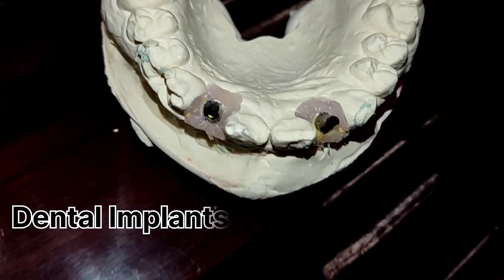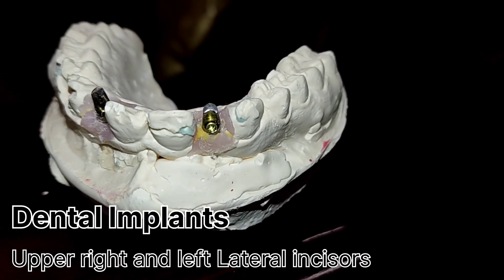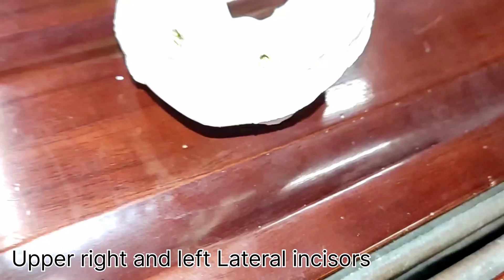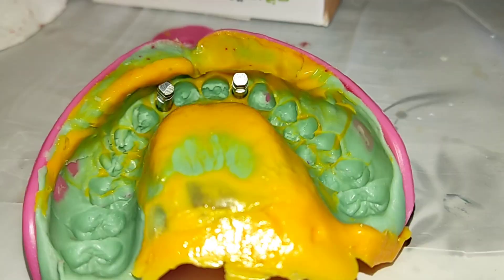Then insertion of zirconia crowns and cementation on dental implant abutments. Nucle OSS is an implant manufacturer founded in Turkey in 2001. It offers a range of 9 bone level and tissue level implants with tapered, straight and tapered apex shapes, and is distributed in over 16 countries.